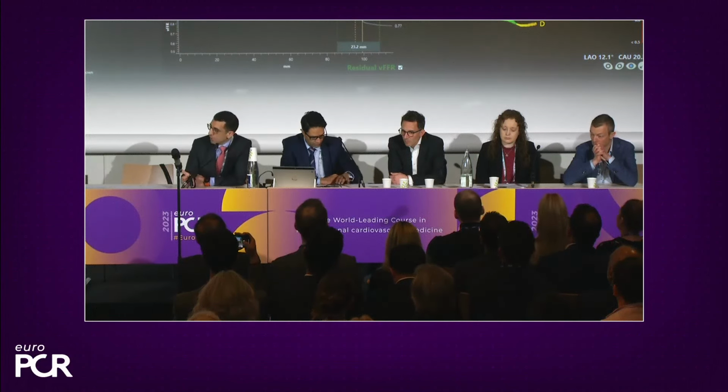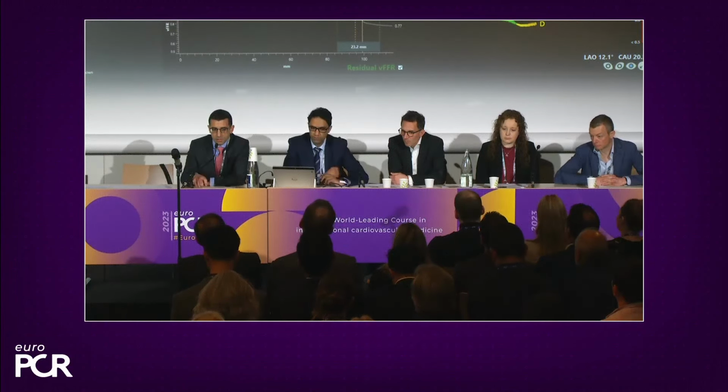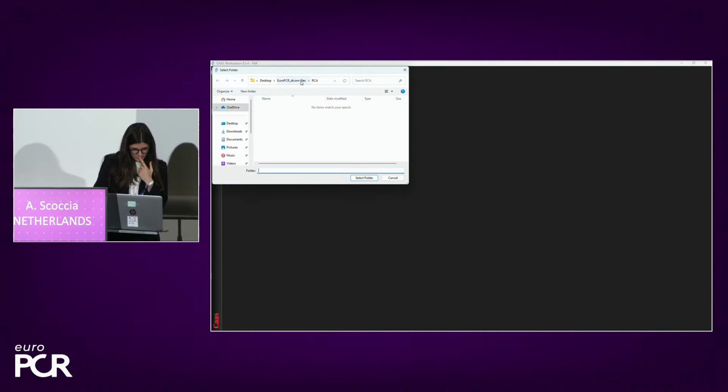So the circumflex was negative. The right coronary artery looks positive. So let's have a quick look at the LAD. So, questions from the audience in the meantime? Will we pull up a question? Please go ahead.